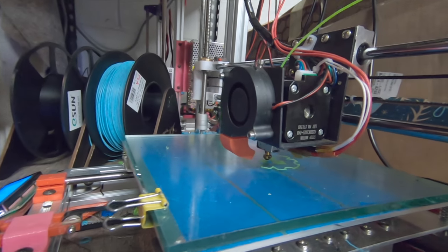And so Ethan is in contact with some medical people back east, and he has this great idea for crowdsourcing through the DIY and 3D printing community a homemade ventilator system that doctors might opt to use for patients who are very severely sick. But I need Ethan to really explain in a little bit more detail how this is going to work.